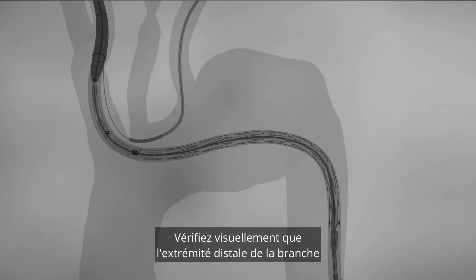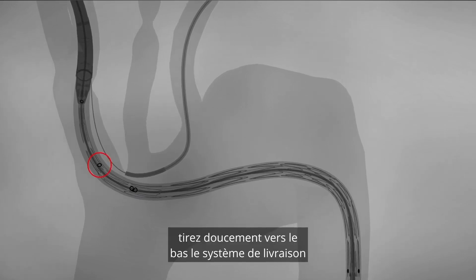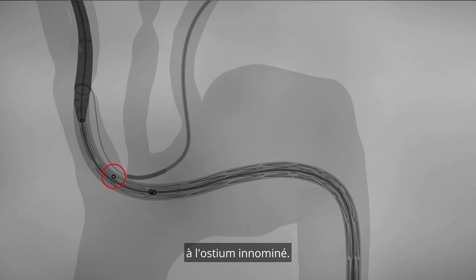Visually verify that the distal end of the branch is not covering the innominate bifurcation. Using fluoroscopy, gently pull down the delivery system to position the proximal branch dot marker at the innominate ostium.